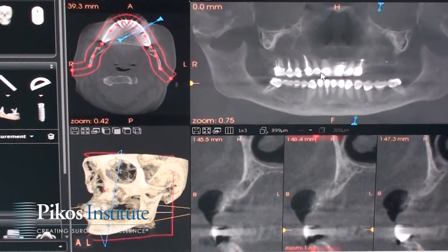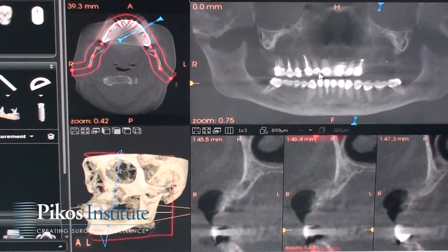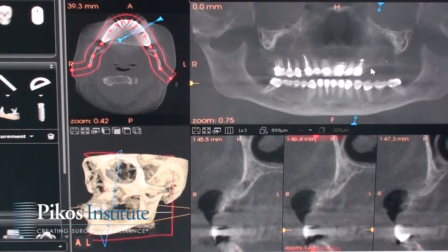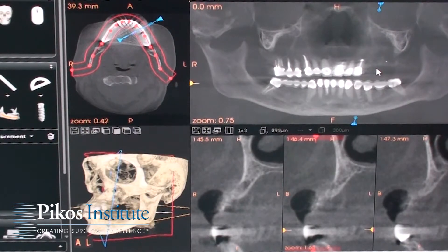This is the Conebeam CT of our patient for this morning. This is a 69-year-old lady that we'll be working on. As you see, she's edentulous in the maxillary left posterior span — the posterior teeth are gone. The goal is to ideally place an implant in the number 12 and 13 site, the maxillary left first and second bicuspid areas.